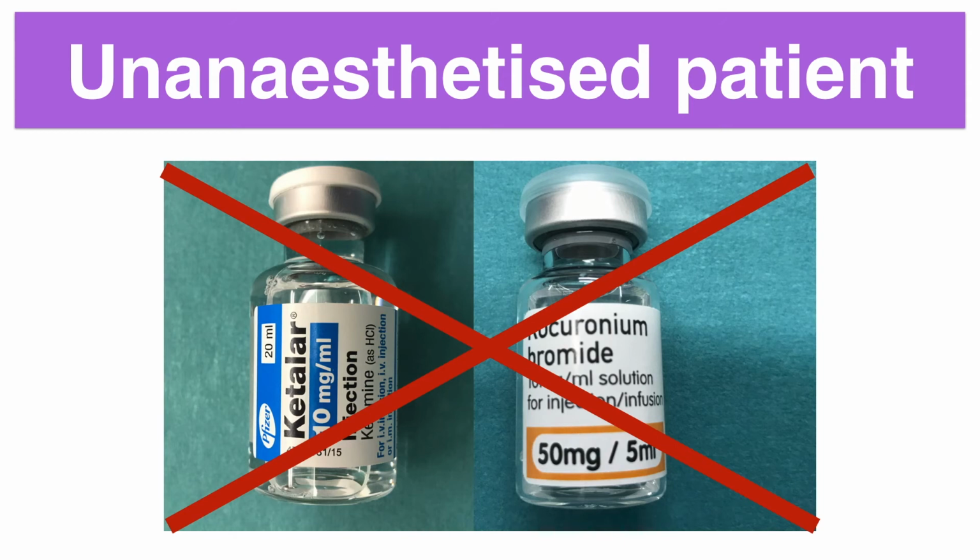I think it's important to say that I do occasionally intubate babies without muscle relaxant if, for example, they have a difficult airway, but they always get an induction agent. So I'm never intubating the unanaesthetised patient, but I know some of you are, so I want to give you an approach for when things go wrong.